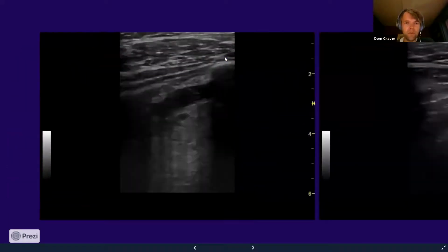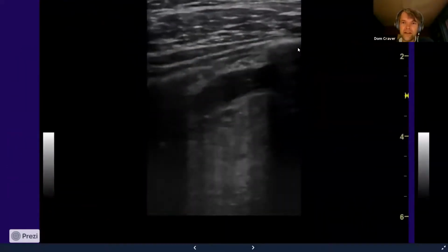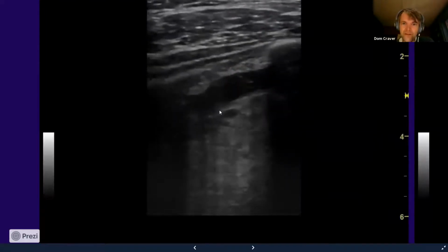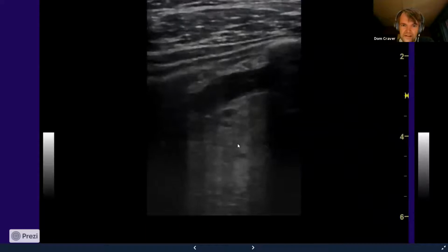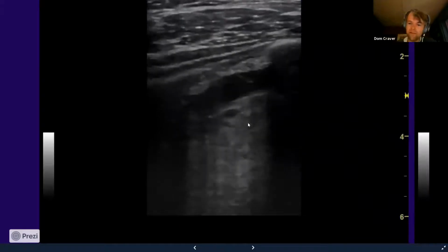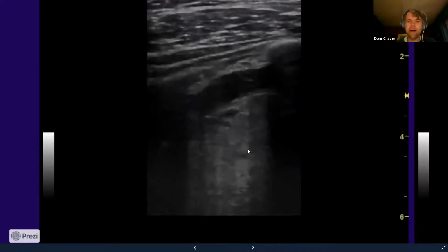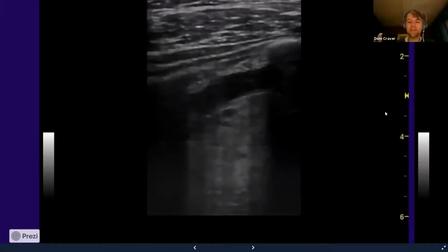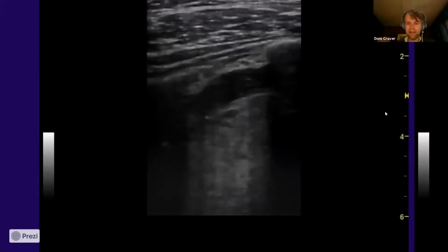So what do we do? So I did zoom there, so you can see a bit closer. So there's a rib shadow. Here's the pleural line. There's probably some fluid, and you can see this mixed heterogeneity there, where there should be air, lung, this kind of mass, solid. So it could be infection, could it be collapse, could it be something more sinister? And while I'm scanning, the SHO is getting more history from the child. So what do we do?